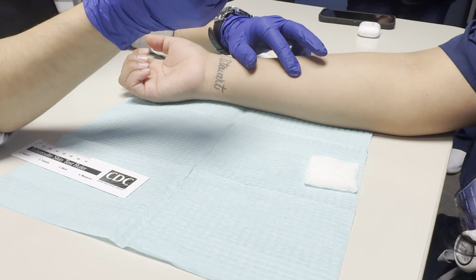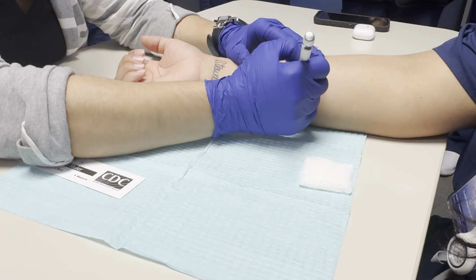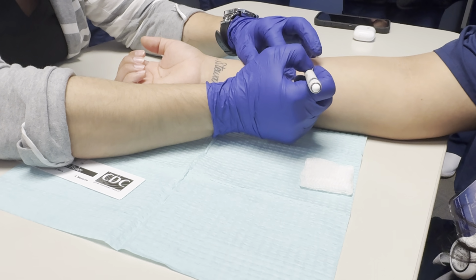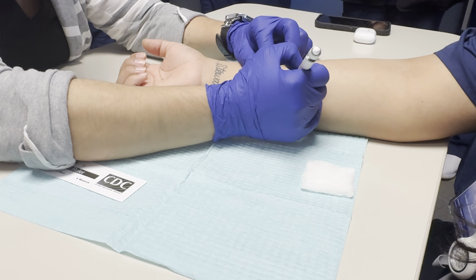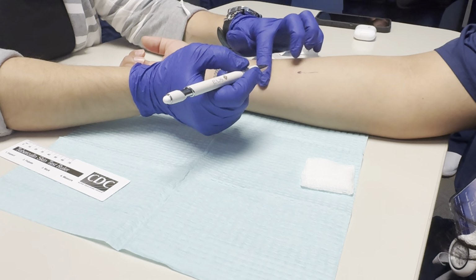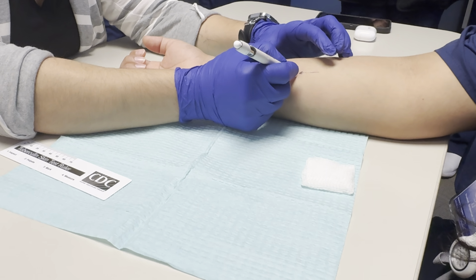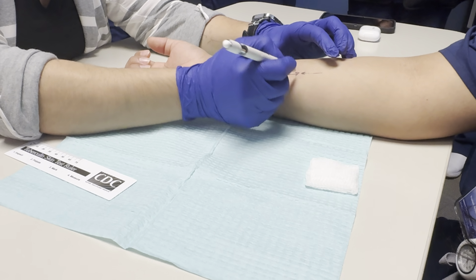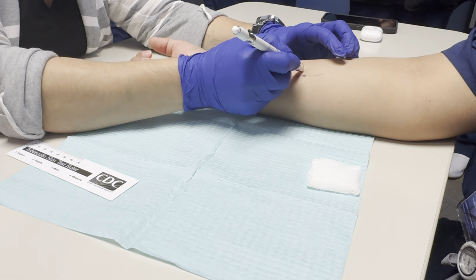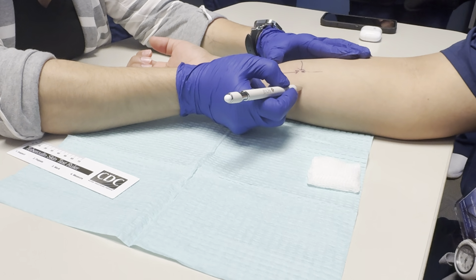Is it okay if I put some ink on you? Okay, so I'm going to grab my pen. I'm going to mark it as I'm coming up. The special pen gives you a resistance. I have such a quiet patient. Okay, all right. All right, stops right here.